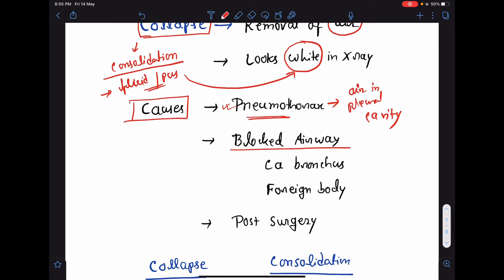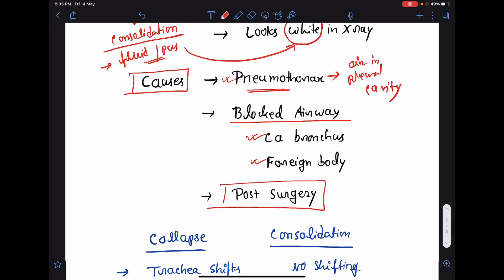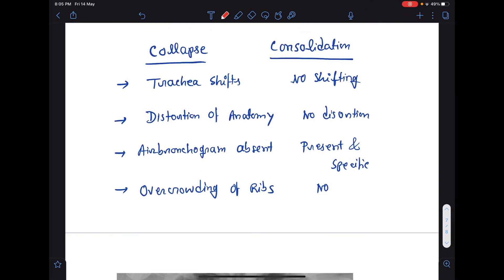Other than pneumothorax, the other causes of lung collapse include blocked airway. If there is blockade of an airway, the lung will collapse. The causes may be bronchogenic carcinoma or CA bronchus. It may be due to a foreign body. Even post-surgery, there may be lung collapse.